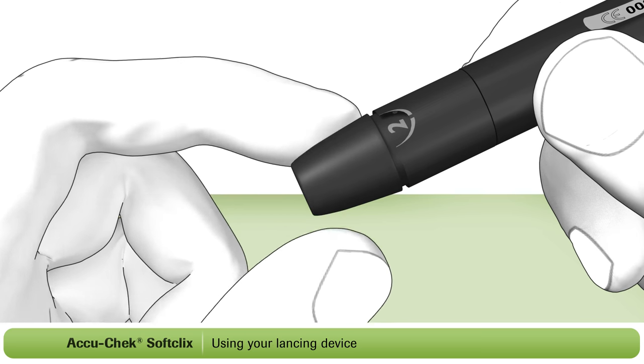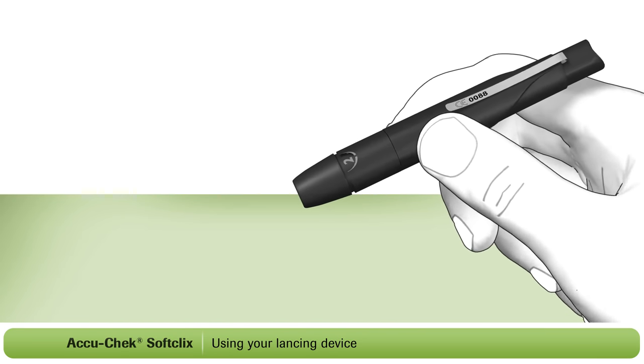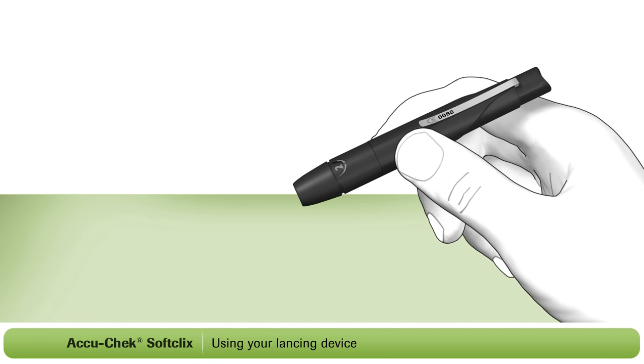Set the dial to 2 to begin with. You may need to adjust the setting a couple of times until you find the right level for your skin type.